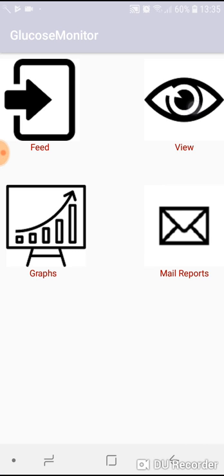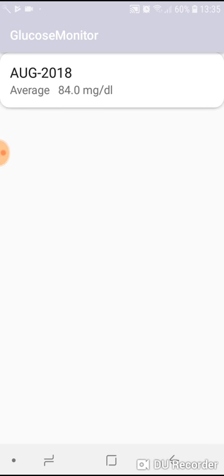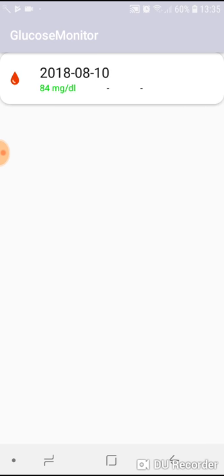If you want to see your value, this is the month of August. Since I have provided only one value, the average is coming 84. If you want to see the discrete value date-wise, just tap it. For the 10th of August, the value in the morning was 84 mg per dL.